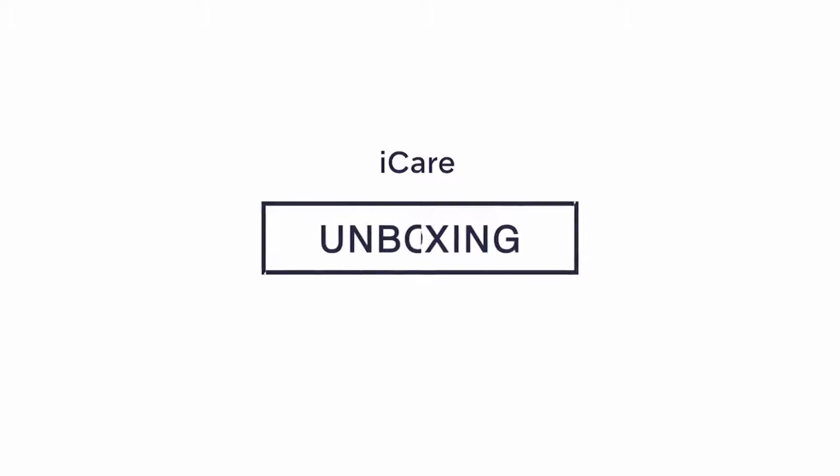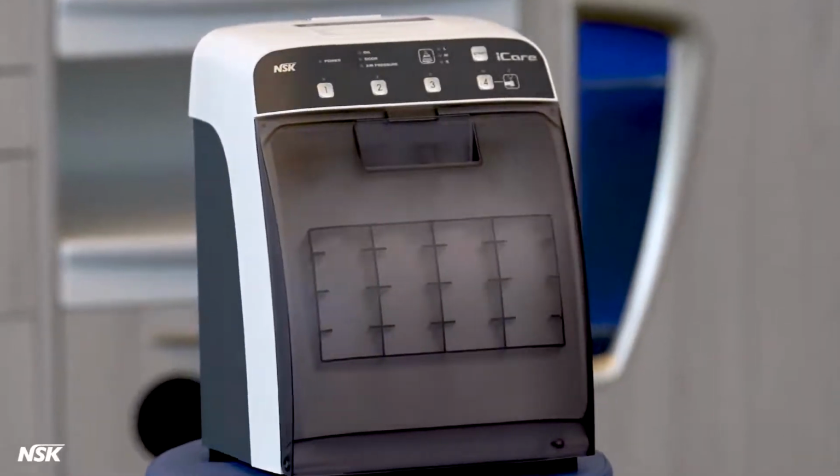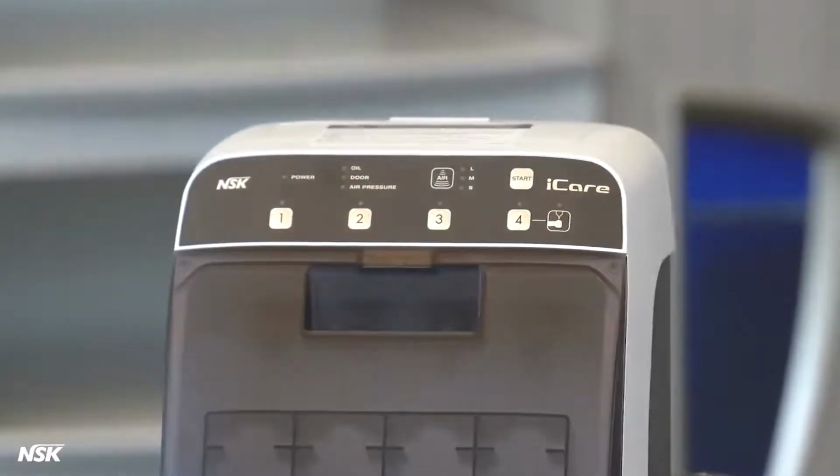NSK iCare, Introduction and Unboxing. iCare is a machine that flushes debris from the handpieces and lubricates them automatically. iCare comes in two different models, the C2 and the C3.